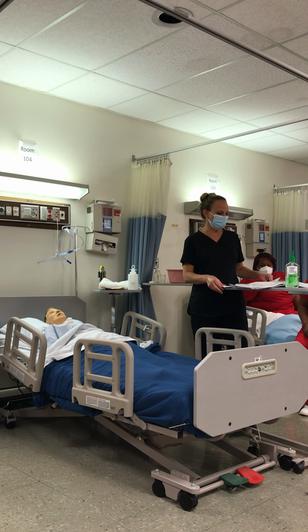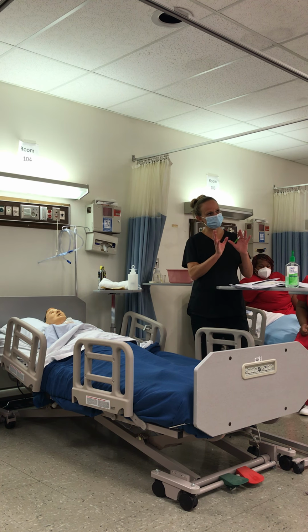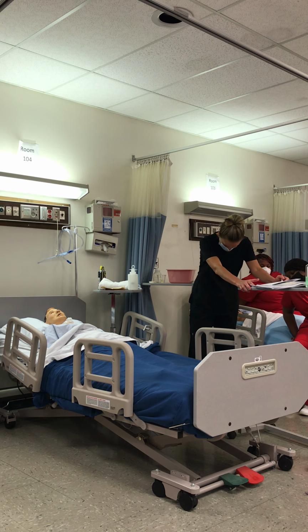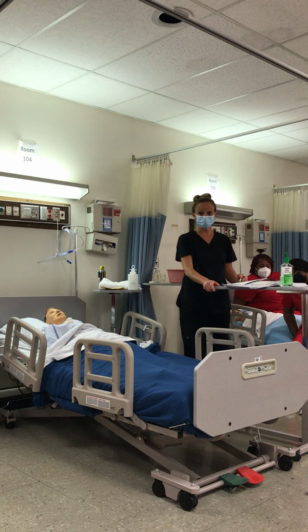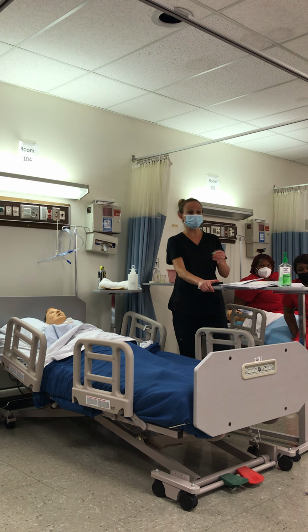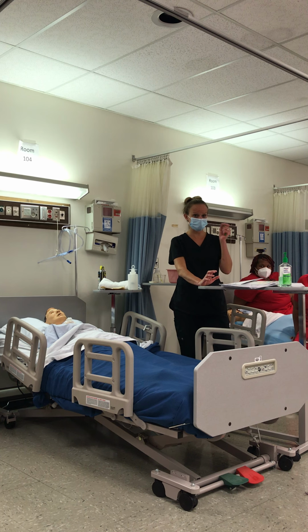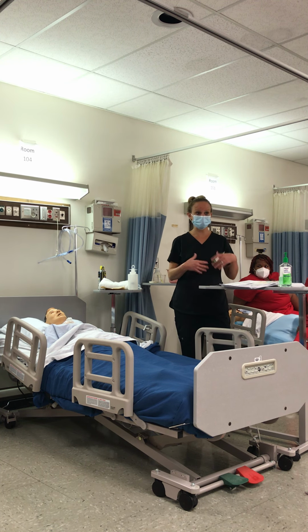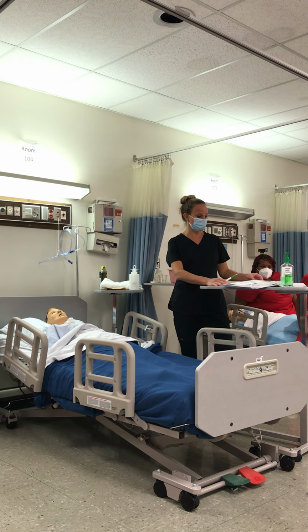We need to know why the patient is getting an NG2, what the diagnosis or concern is. Why do we need to know that? So you can explain it? That's one thing. To make sure you're using the proper materials? Yeah, because size matters as far as what tube you're going to use. To know what you're going to be working with and what to assess. If somebody has a blockage or if they're vomiting, you need to be prepared to go in there with something to help them if they do get sick, in order to know what to assess for, okay?